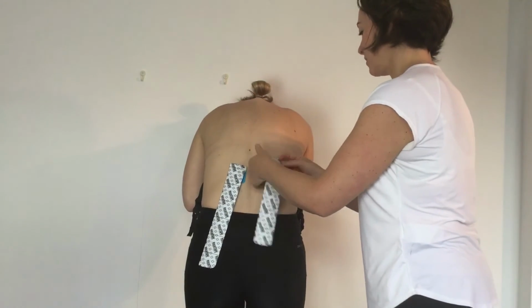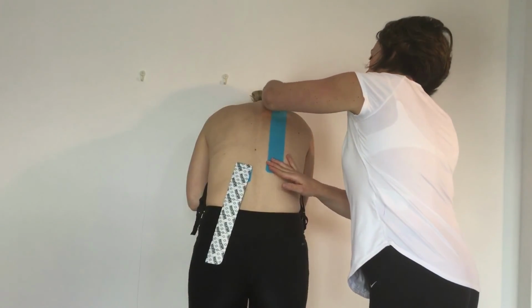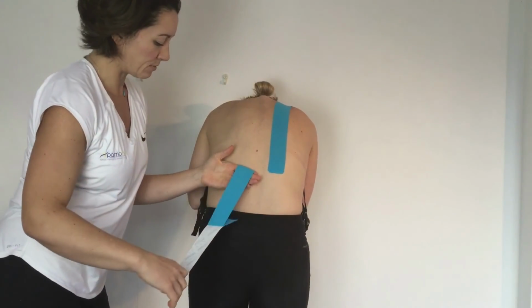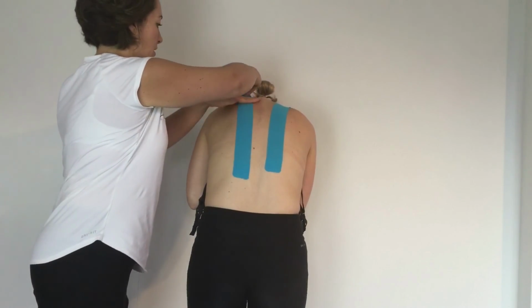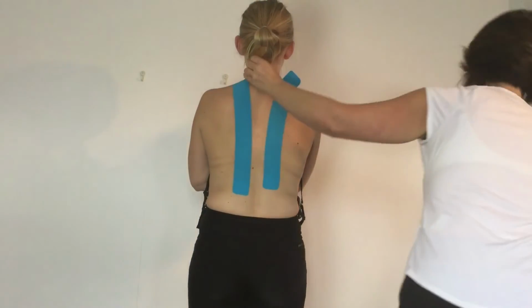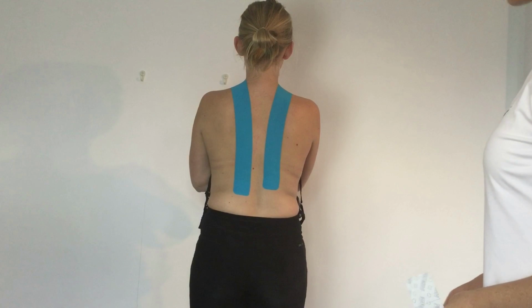Now I'm going to ask my client to stretch that tissue by bending forward. And now I'm going to add a medium amount of tension to the tape, so stronger than if we were inhibiting, and lay that down right through that thoracic spine, rubbing well to stick. So again, peeling back that active portion of the tape, adding a medium amount of stretch to that tissue and placing it down on that stretched tissue and rubbing well to stick. We really want to rub it well because there's stronger tension. And then we simply anchor the last 3 or 4 inches of tape around the front of the client with no tension and no stretch. So almost like two hands helping to pull the client back into extension.